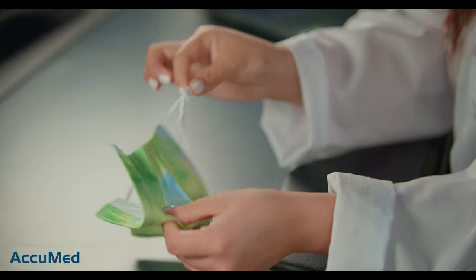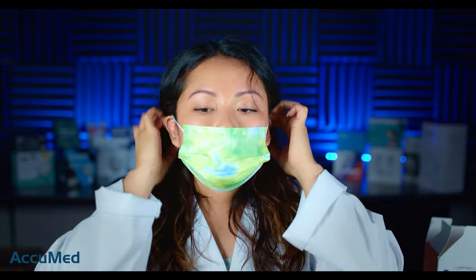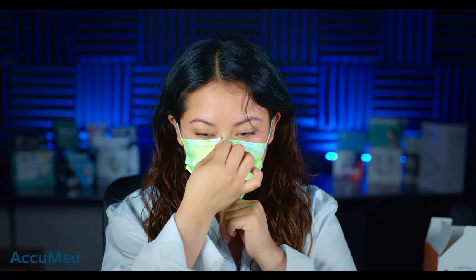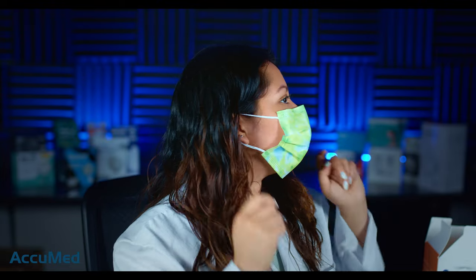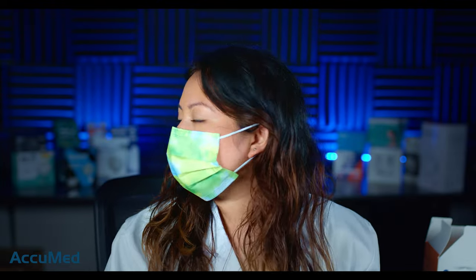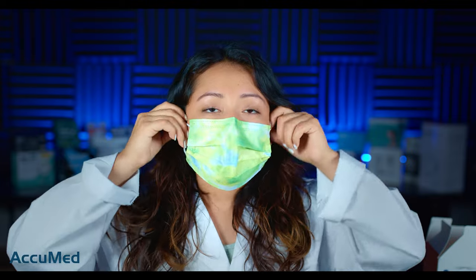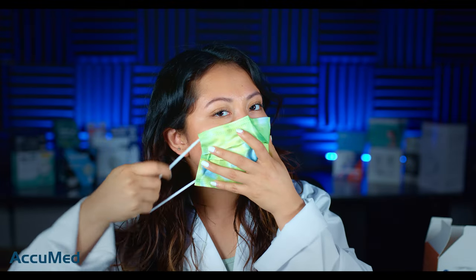They're not going to be the best quality masks. Let's go ahead and put one on — I'm going to grab a new one. Here is how they look on. I am getting a lot of leakage on both sides. The nose wire is pretty flimsy so I don't feel like I have a perfect seal, and I'm also getting some leakage on the bottom of the mask.